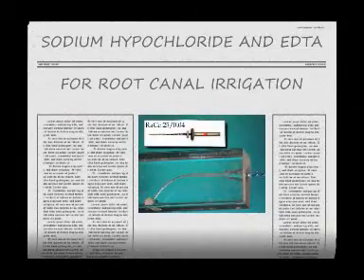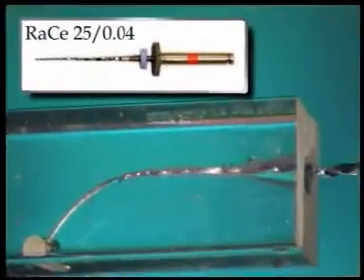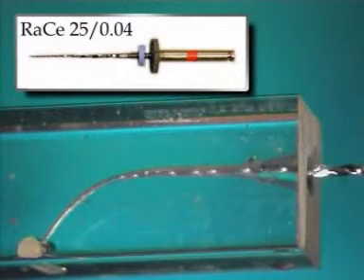Raise 2504. Light strokes. And we are almost to working length.